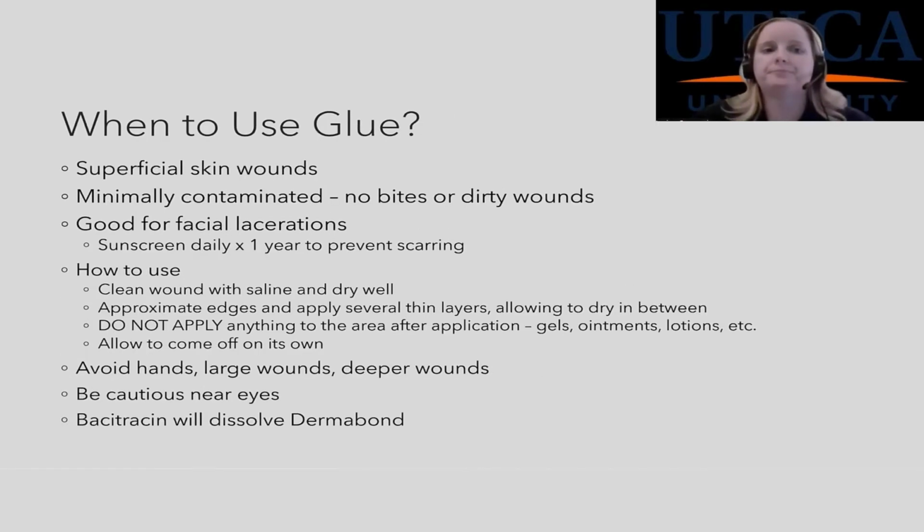That's okay too. So when do you use glue? Glue is used for superficial skin wounds. They should be minimally contaminated, so no bites or dirty wounds. Why? Because if you put glue over something contaminated, it's got nowhere to breathe and nowhere to drain, because you've put a layer of glue over the top of it. Now all of the germs are inside. At least with sutures, you've got holes on the side of each suture where things could drain out. With the glue, it's got nowhere to go.